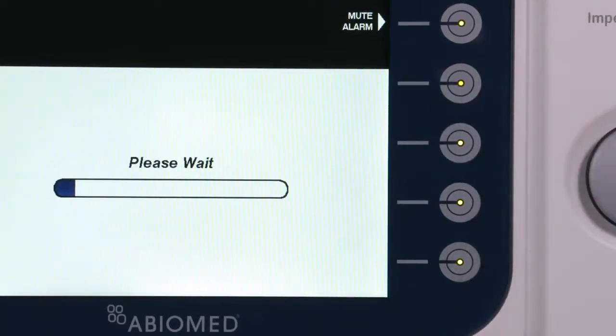A blue progress bar will appear while the automated Impella controller primes the system. Once completed, the AIC will automatically advance to the next screen.